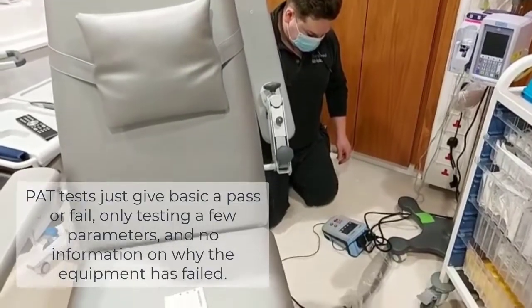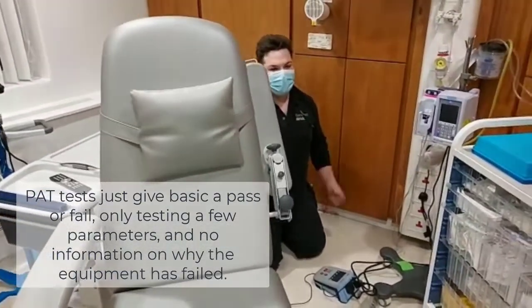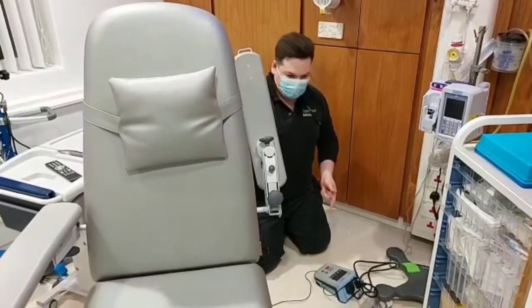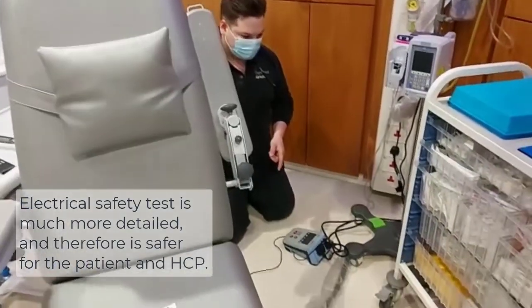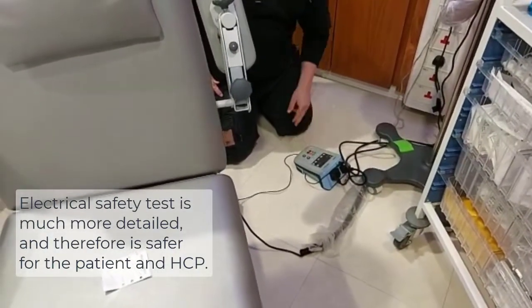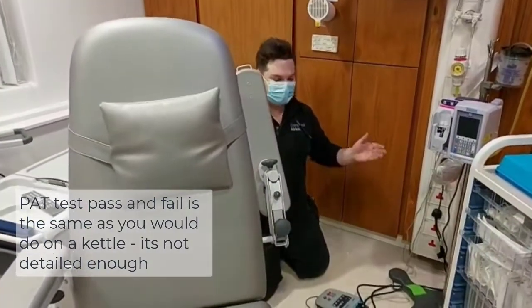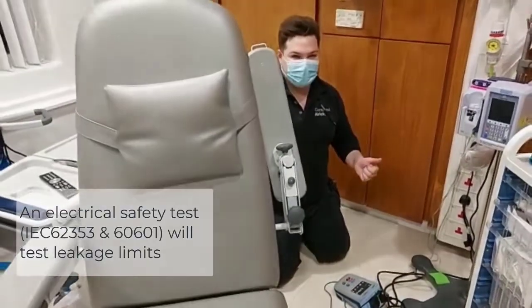A PAT test will give you a straight pass or fail — it will only do earth bond and insulation tests. What an electrical safety tester specifically for medical equipment will do is give you an actual reading instead of just a pass or fail. The parameters for pass and fail for medical equipment are different to a normal appliance like a kettle.